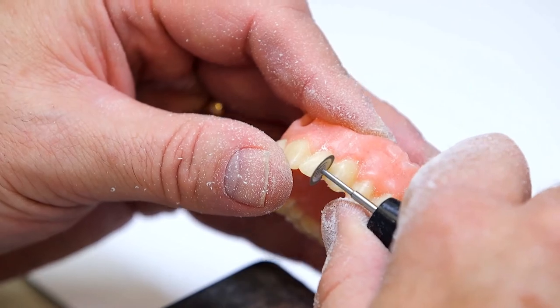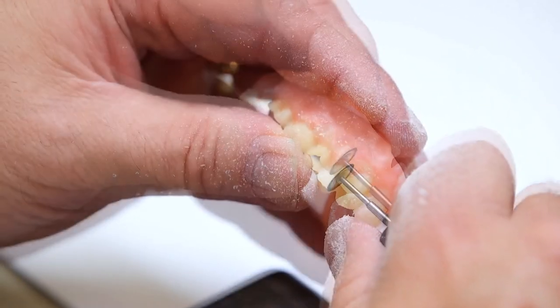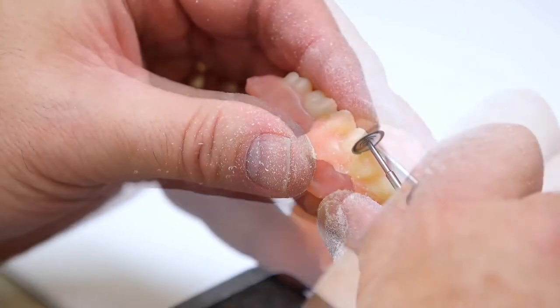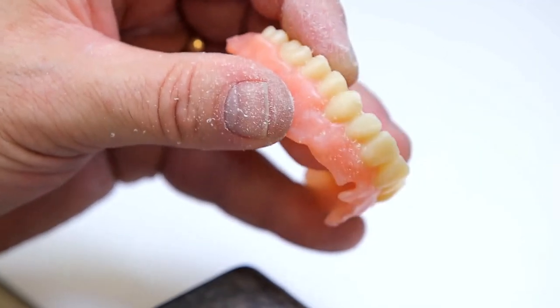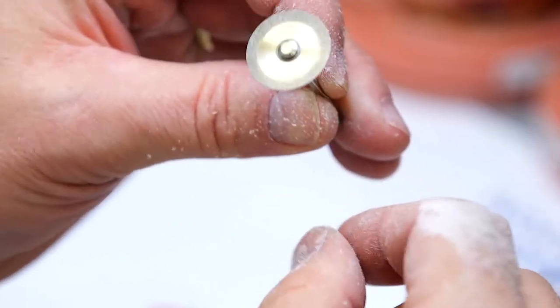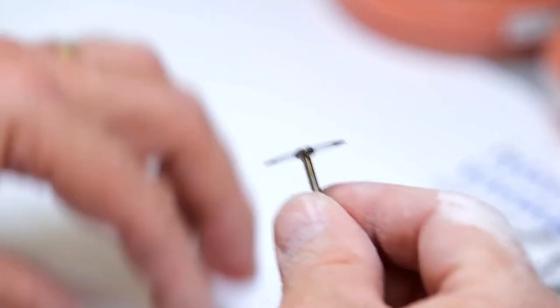So you have to take your time, go slow. There's no hurry the first couple that you do. I'll just do the anterior six right now. The smaller disc works a lot better than, say, a large disc like this. This disc, even though it's thin, it's nice, you just are not able to get into that interproximal without cutting into your papilla area. So I just leave the large disc for my ceramics.